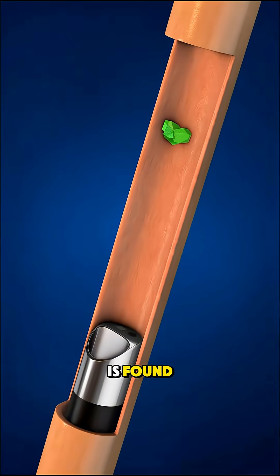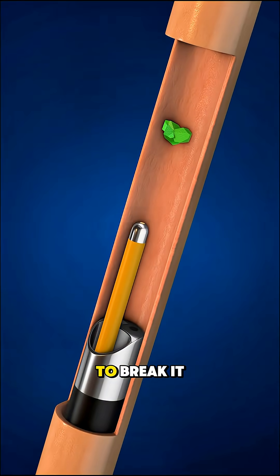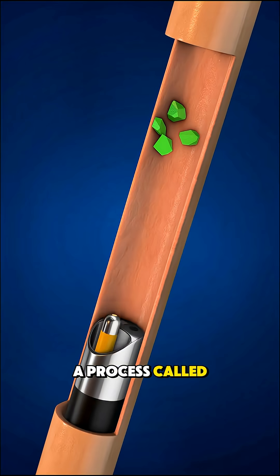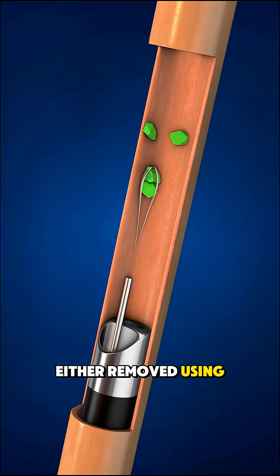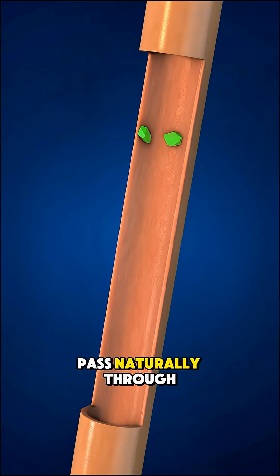Once the stone is found, a small laser fiber is used to break it into tiny fragments, a process called laser lithotripsy. These fragments are either removed using tiny baskets or left to pass naturally through the urine.